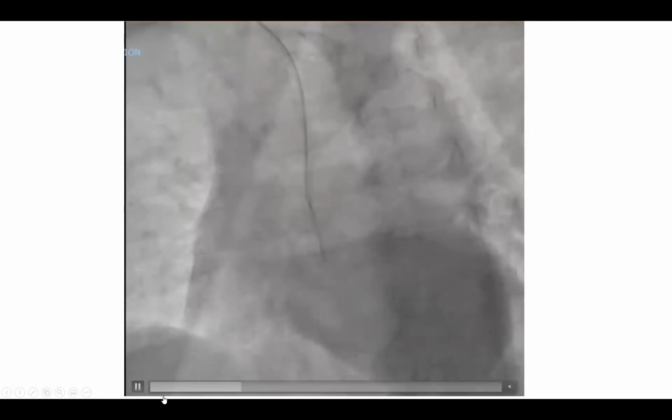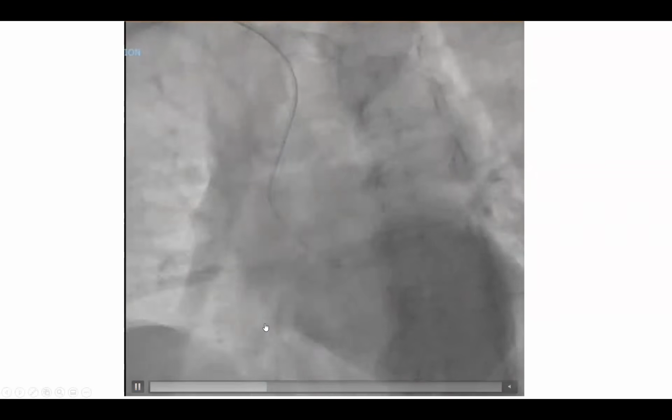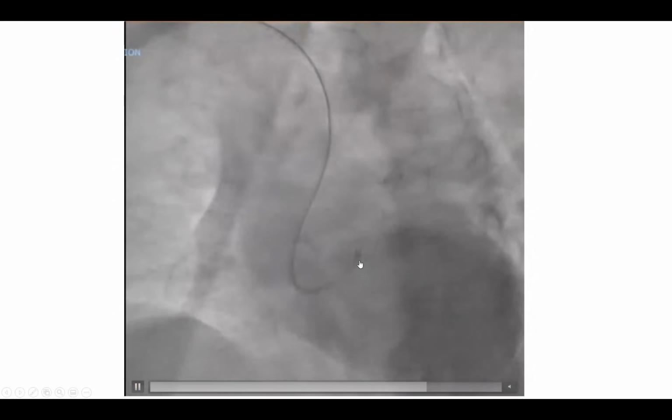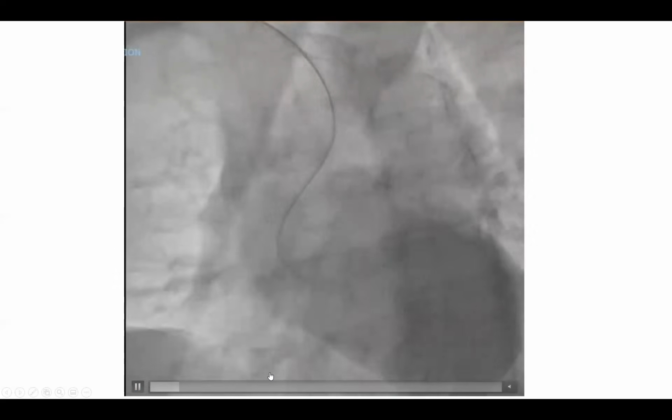So we started on the right cusp. Notice here in the jump, as we're trying to jump into the left cusp, the catheter is about to fly out. Again, this is always the critical point in radial maneuvering. We immediately reverse torque and we were able to jump successfully into the left cusp and we pushed it. As we're pushing, sometimes I do a slight torque to get it in a better plane, and we got in and obtained extra robust support.